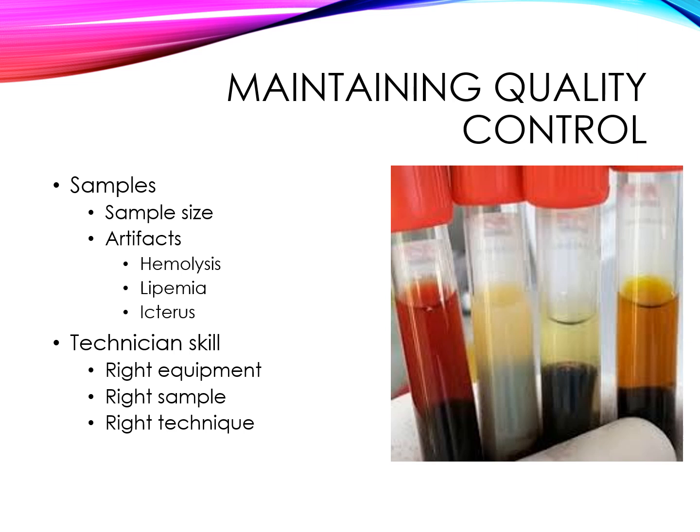And then any artifact that may be in the blood. Certain artifacts that we're going to discuss specifically are hemolysis, which is the first one, or cell lysis on the left here. That can happen due to different diseases, but it can also happen due to errors in either obtaining the blood or not letting it finish clotting before you spin it down, or not spinning it down enough so that the blood's not separated enough. And this can affect certain results, like magnesium and potassium can be falsely elevated. Liver enzymes can be messed up.